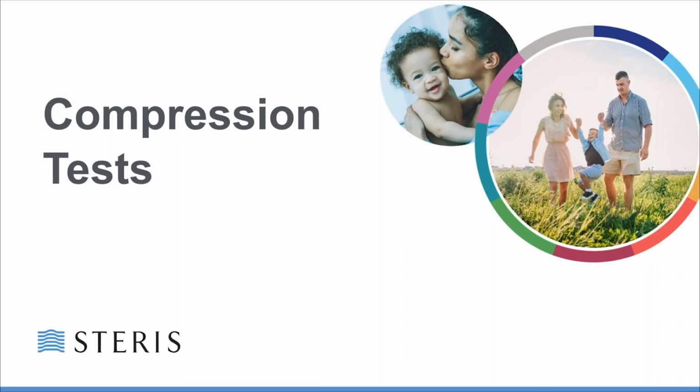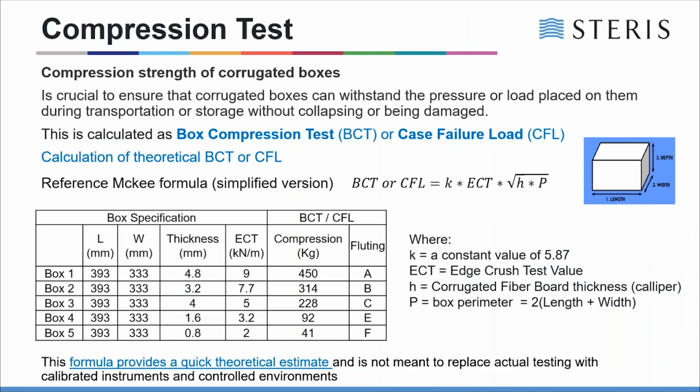Compression testing. To me, this is a very significant test in that it's a health and safety factor, because if you have a box level or a pallet that's stacked 10 or 15 high, and you put another pallet on top of it, what's going to happen to the bottom boxes?